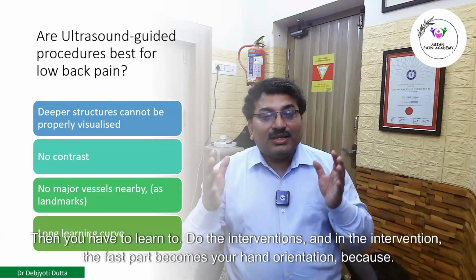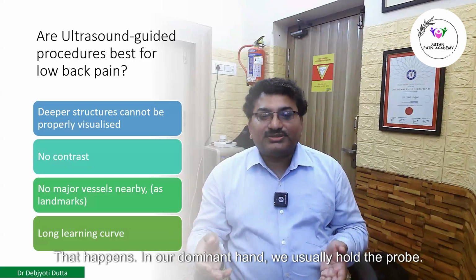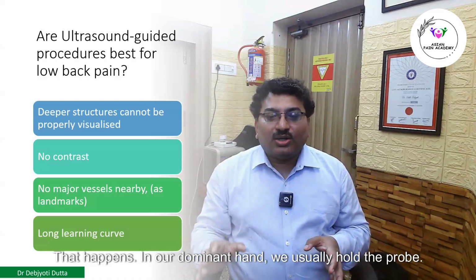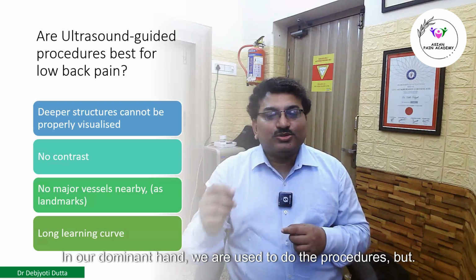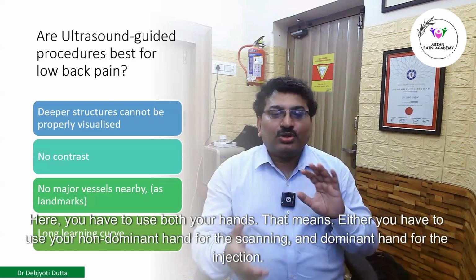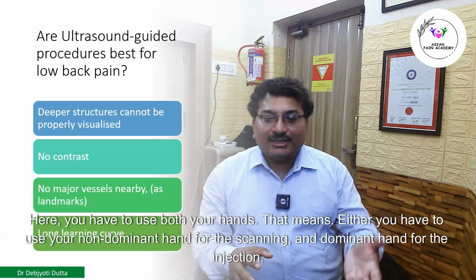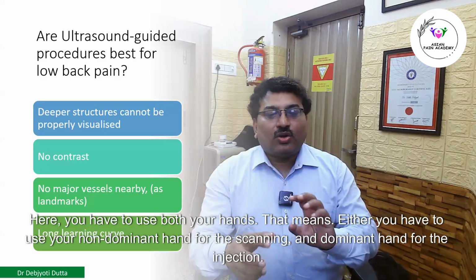And in the intervention, the first part becomes your hand orientation, because in our dominant hand, we usually hold the probe. In our dominant hand, we are used to doing the procedures. But here you have to use both of your hands. That means either you use your non-dominant hand for the scanning and dominant hand for the injection, or the reverse.